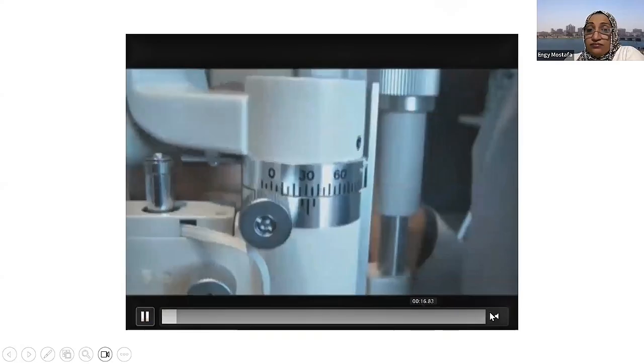Some people say, I do not acquire this image. Actually, when you see the first Purkinje image, you can move your optic section towards this image and then increase the magnification and move back and forward in very minute millimeters so that you can find an image of the endothelium. So this is the reflection from the front surface. This is the first Purkinje image, and you use it to move forward to acquire a good preview of the endothelium.